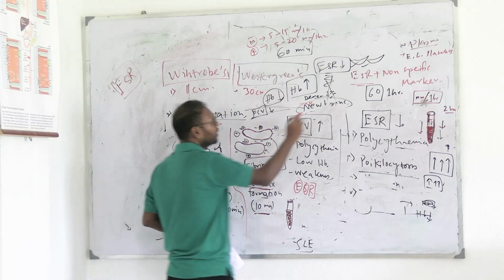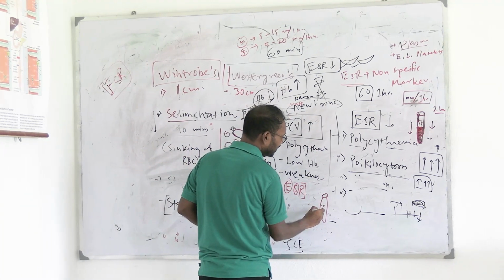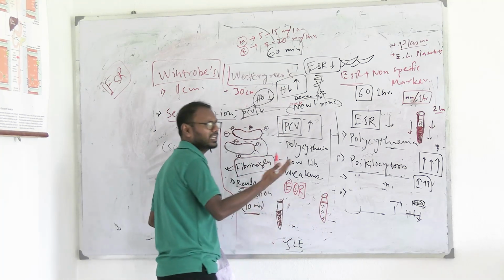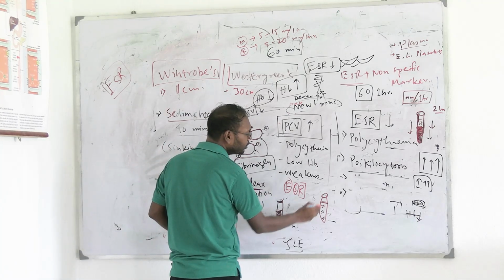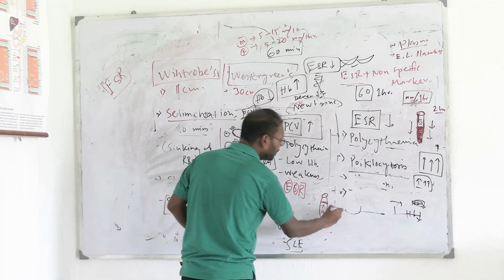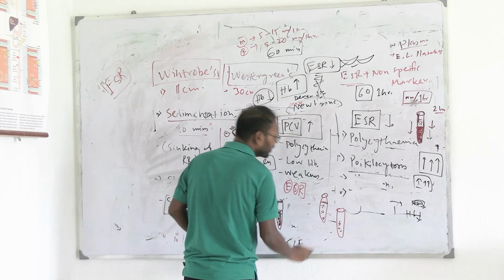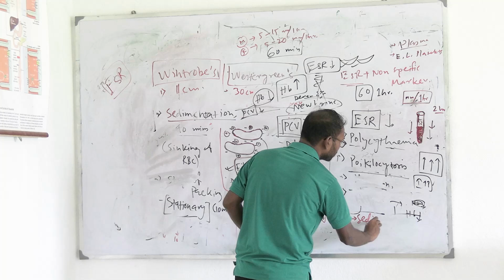So it is not the case that they are getting clumped in the test tube but are not at the bottom of the test tube. They take some minutes. The first, the rouleaux formation, takes 10 minutes. Then this rouleaux will be getting down slowly. So this procedure is called sedimentation.